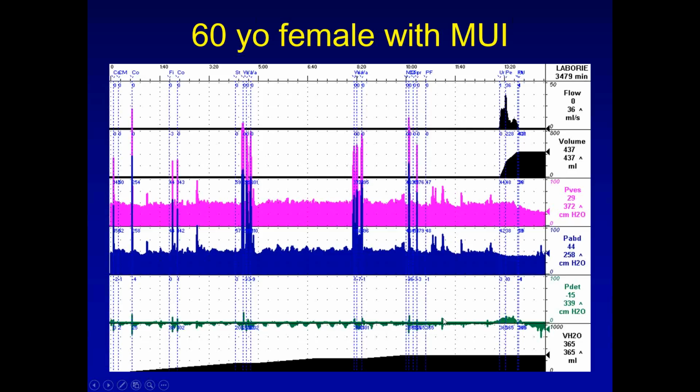She holds a good amount. She did have stress incontinence. Her Valsalva leak point pressures, I'll give you in a minute, I can't see it. I have it written down on the next slide. And then she voids, and you can see she does void with a voluntary contraction. It's not very high. She's got a great flow rate. Qmax was 36, but this is, again, to the same person who asked, this machine picks up whatever it sees in this line. This is a spike, and this could be a strain or it could be an artifact. And actually, I think it's an artifact. But it went up to 36. But the machine saw it and said, oh, that must be Qmax. In reality, your Qmax is over here, which is about 24, which is still about par with what our Uroflow showed. So again, that's why you can't just go with that right column, because it'll identify anything.